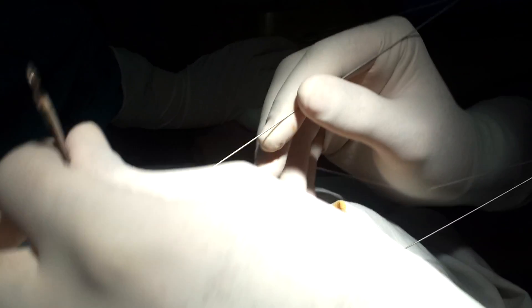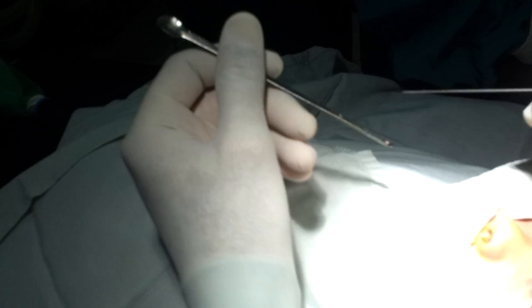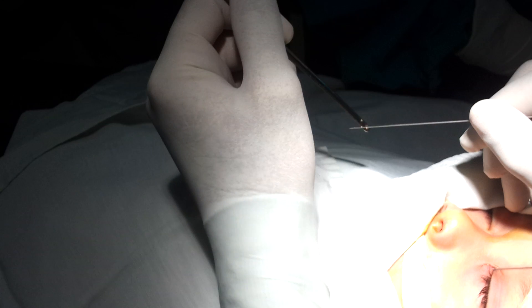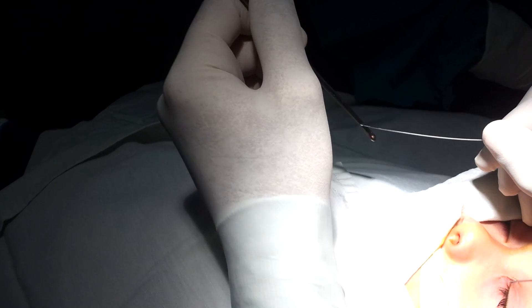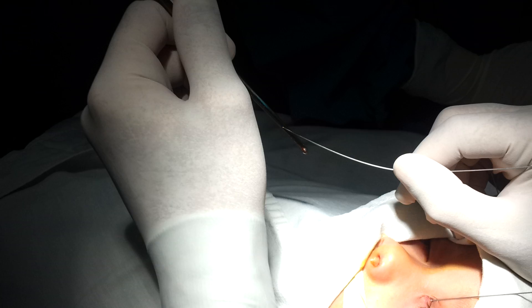What you expect is: you feel your wire wherever it is, and then you get it impacted here, and then you pull up. This is how you feel your wire — here or there — and then you get it impacted here, and then you pull up. It stops here when you are pushing against each other, and then you manage to make it slide up.